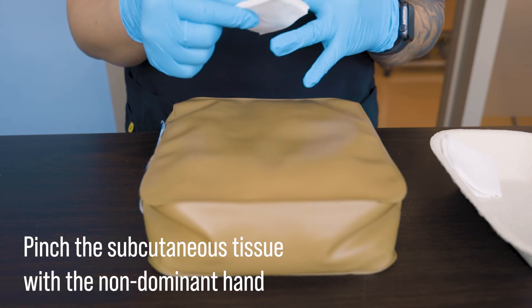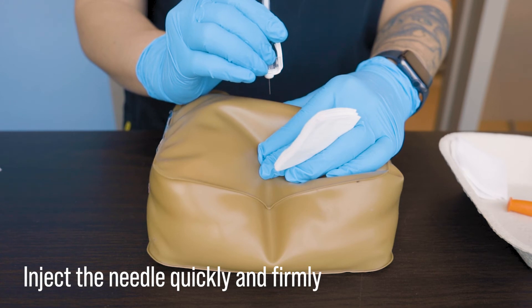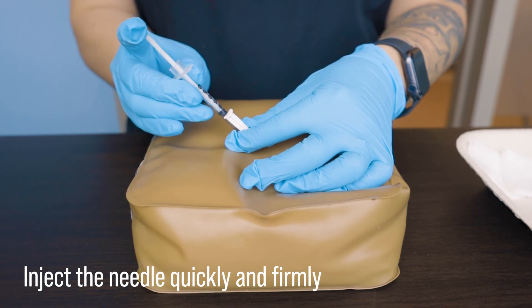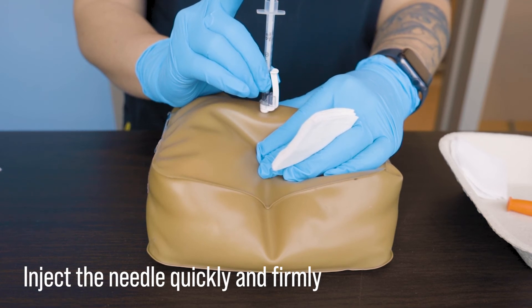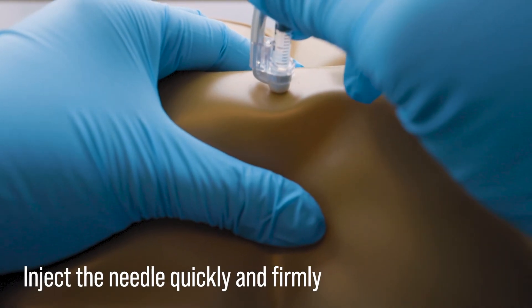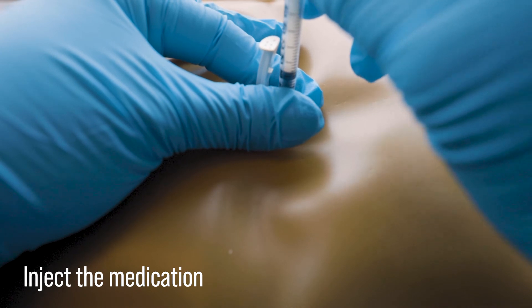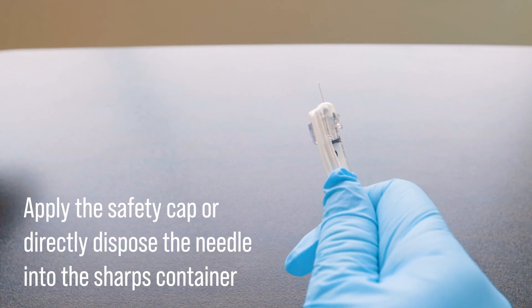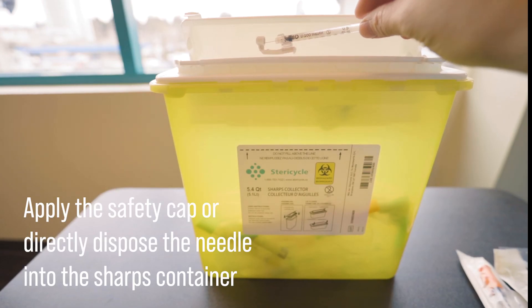We're going to pinch the skin and subcutaneous tissue with our non-dominant hand and inject the needle at a 90 degree angle. You may need to inject at a 45 degree angle if the site does not have sufficient subcutaneous tissue to pinch. Holding the syringe like a pen, we want to inject the needle quickly and firmly in a darting motion and then gently administer the insulin. You can either keep the pinch during administration or let go and use the fingers on that non-dominant hand to anchor the syringe in place. Draw the needle carefully and apply the safety cap using your thumb or the edge of the table, or just directly dispose of the needle in the sharps container.